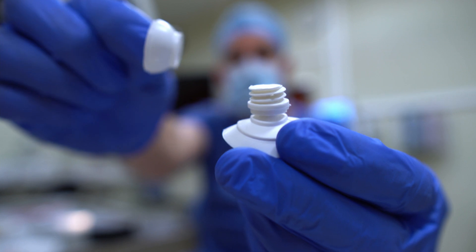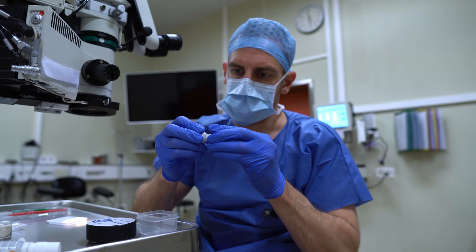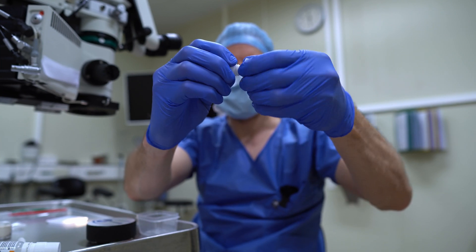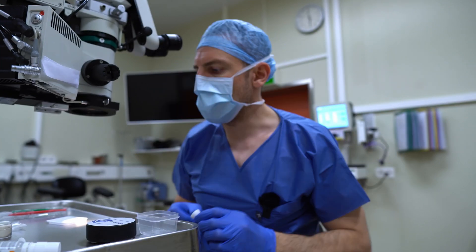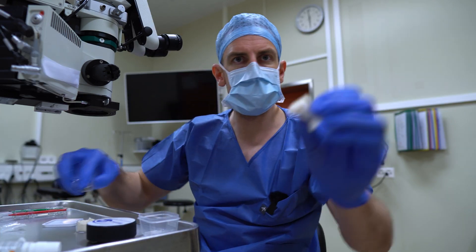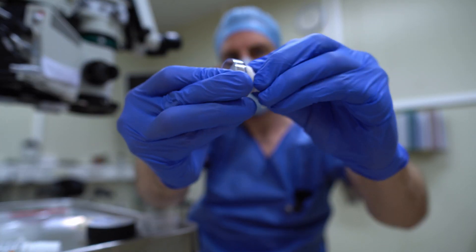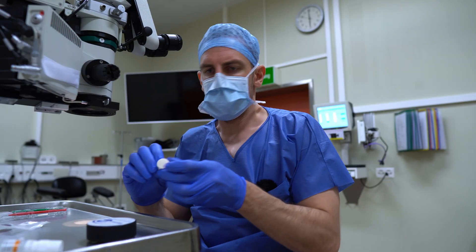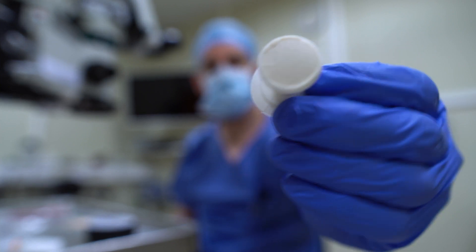You can screw one part into the other and thereby tighten it. You're supposed to screw it all the way in and then three quarters back so you can tighten it later on. Fill it with some polymer, remove the excess polymer, and do this again. This way we have a pretty nice flat surface.